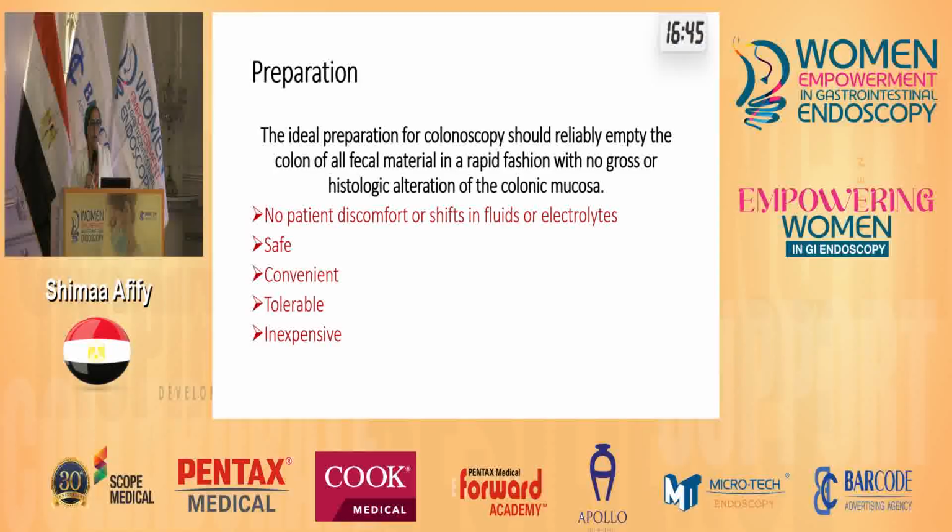So the first step after requesting a colonoscopy for an indication is how to prepare this patient for a colonoscopic examination. And this is a very vital step. Without it, the quality of the examination will be subjected to many questions. The ideal preparation for colonoscopy should reliably empty the colon of all fecal matter in rapid fashion with no gross histological alteration. So it should be with patient comfort. It should be safe, convenient, tolerable, and inexpensive.